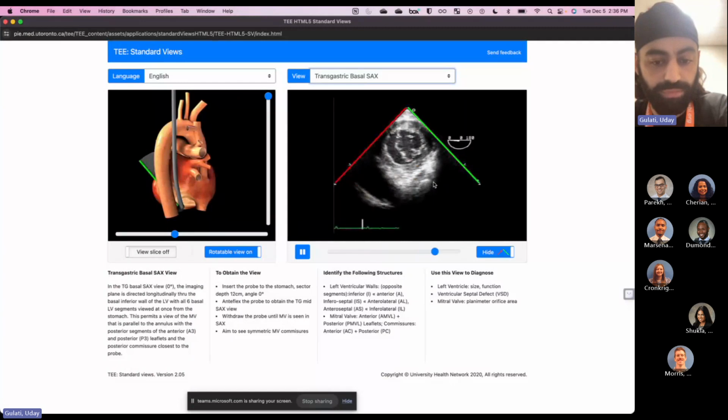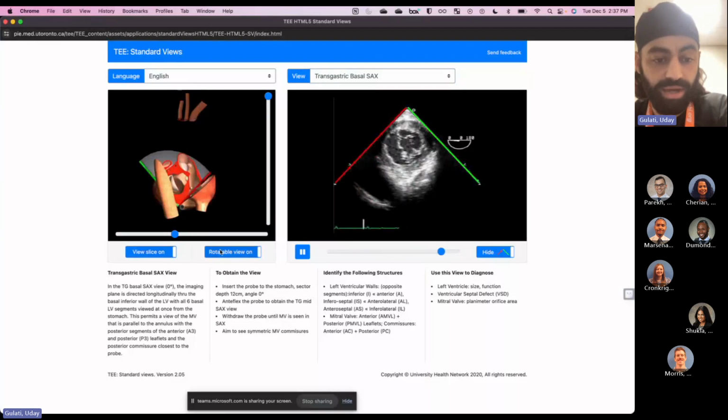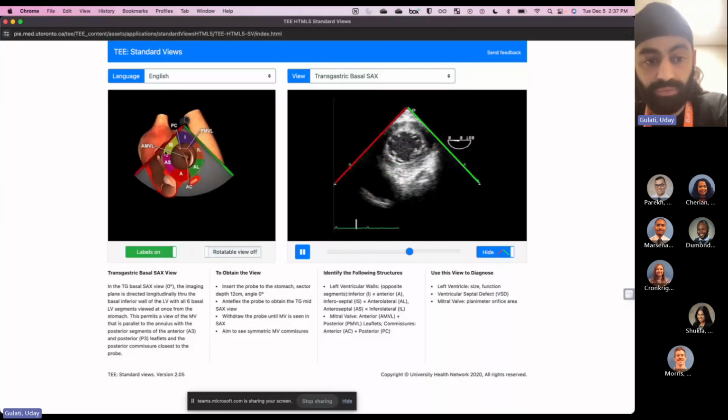And if you're looking at a little more of your mitral valve parameters, you can. For your patients with a STEMI, we always try to figure out which vessel is affecting which area, and then you can really break down which area of the myocardium is affected by, for example, an acute STEMI, right?